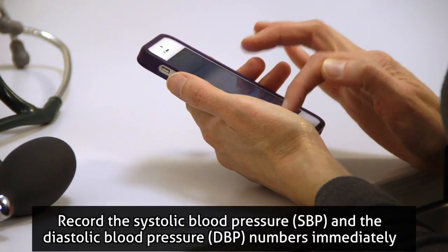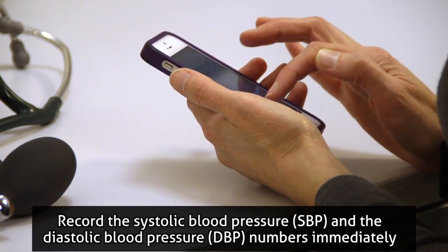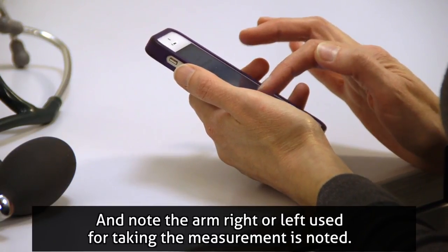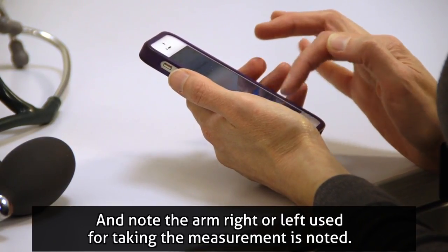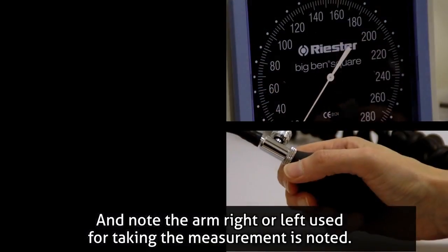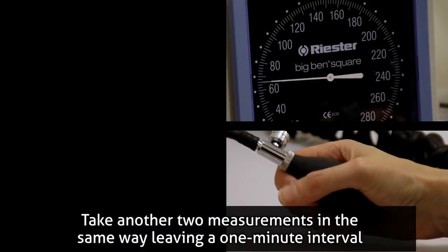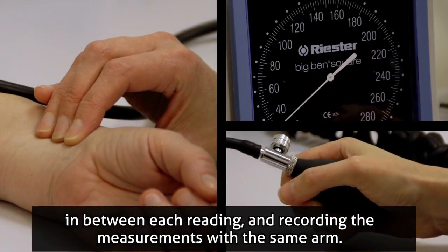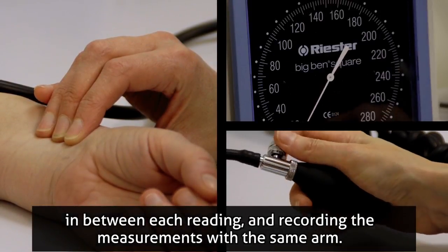Record the SBP and the DBP numbers immediately — don't depend on memory — and note which arm, right or left, was used for taking the measurement. Take another two measurements in the same way, leaving a one-minute interval in between each reading, and recording the measurements with the same arm.